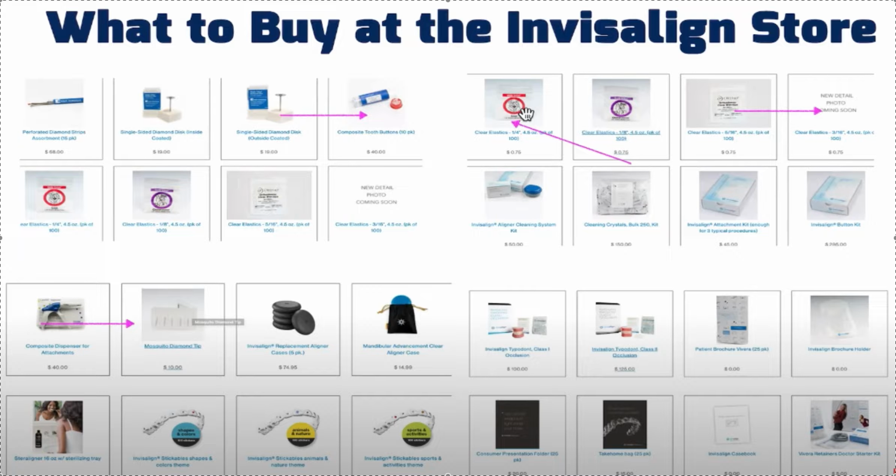Also, a lot of the more patient-facing stuff, like replacement cases or more fun color cases or stickables, cleaning stuff, they have a patient-facing consumer store that you can send the patients to, or you can get all this stuff from Amazon too. It just wouldn't be Invisalign branded. Obviously they're going to get one case that comes with every kit when you deliver it. It's just going to be a black one. It's not that exciting. If they want colored ones, they can go to the patient-facing store and get their own stuff. If they want stickables, they can go get their own stuff.